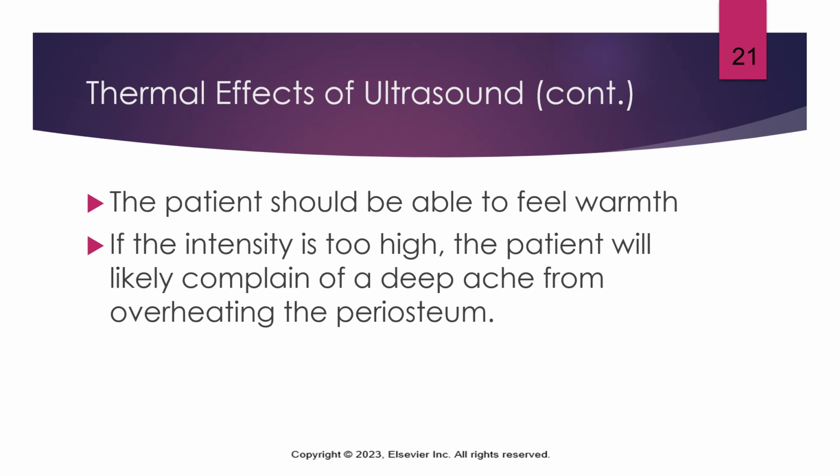We have to let the patient know that, yes, it's okay to feel warmth in the area because we are using thermal ultrasound. We are creating heat, but we want them to be aware of this kind of deep aching sensation. If they start to feel that, they need to tell us right away because there's a chance that we're burning the periosteum of the bone, which is no bueno.